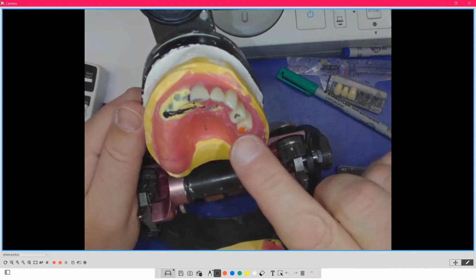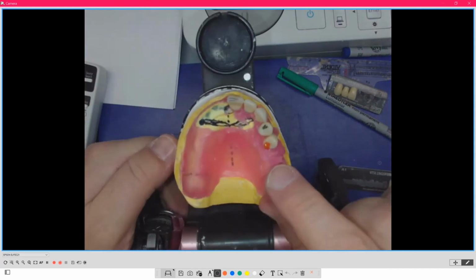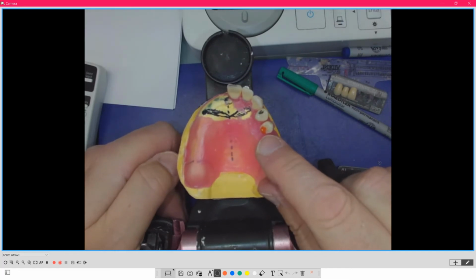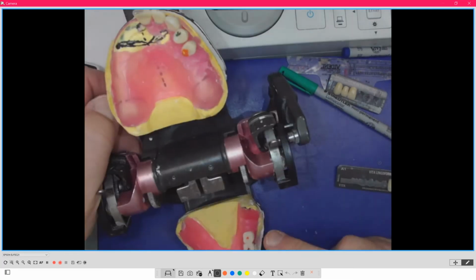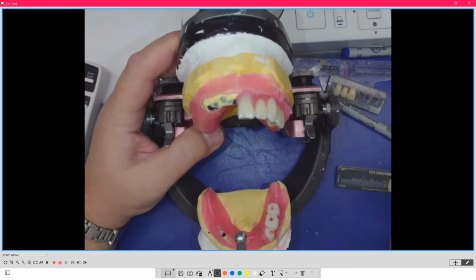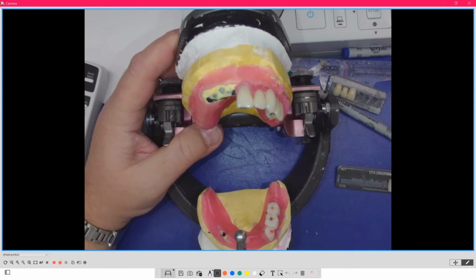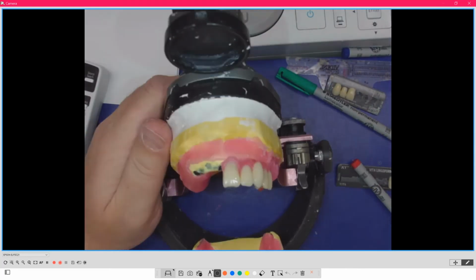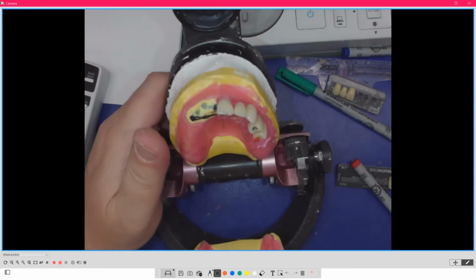Now this is a smaller cusp. It's smaller than the first molar, so it's a little bit less efficient because it's smaller, but it's still a cusp in the lower fossa. That doesn't matter. Sometimes, again, it may not be the ideal, but it's going to work. And it's going to work because it still follows the freedom. It still has freedom in centric. So now what we can do is I can actually add in a second.